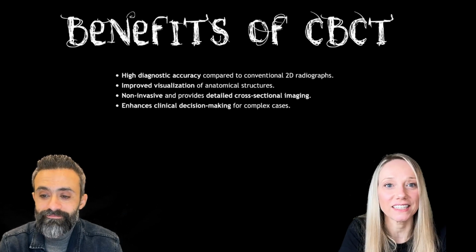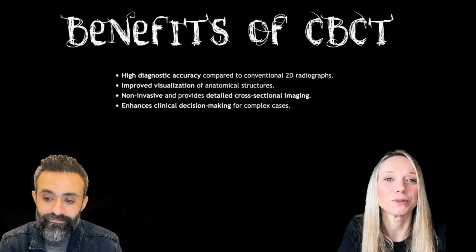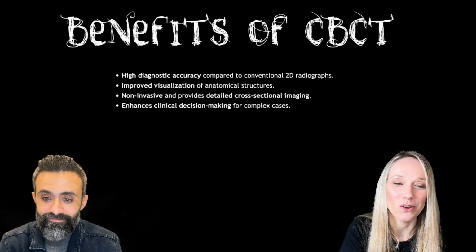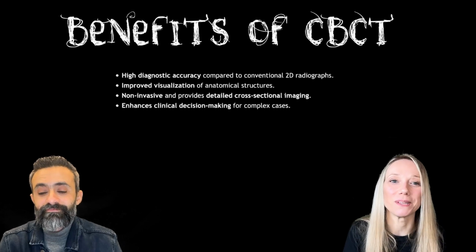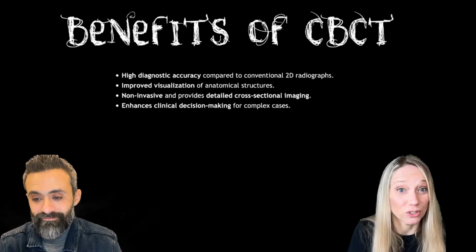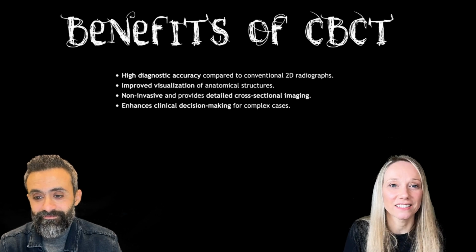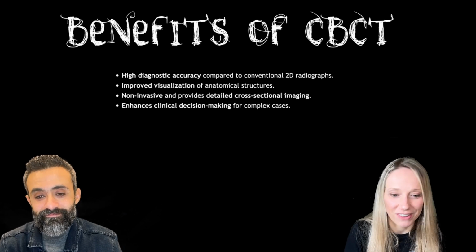And last but not least, there is some article that says that even experienced clinicians change their treatment planning when they are able to see a CBCT instead of a bidimensional X-ray. So this is very important because it means that it can enhance our evidence-based decision-making process.